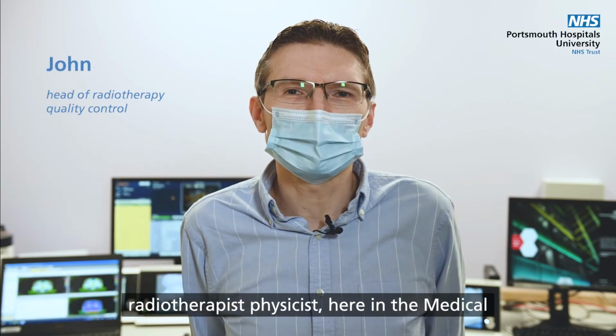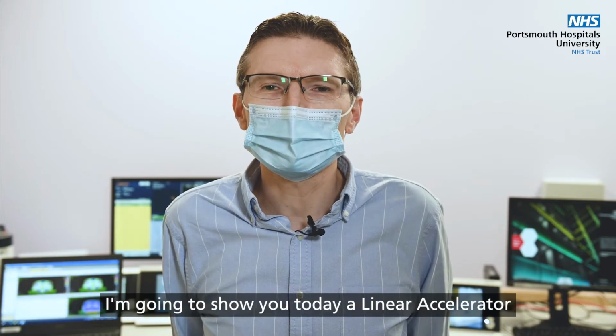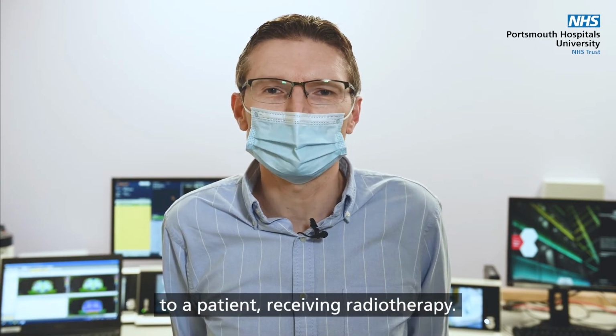I'm a radiotherapy physicist here in the Medical Physics Department at QA Hospital, Portsmouth. I'm going to show you today a linear accelerator, LINAC for short, which is used to deliver high doses of radiation to a patient receiving radiotherapy.